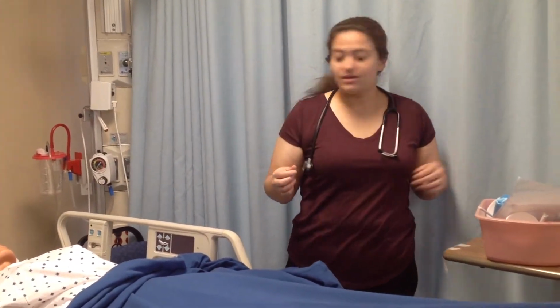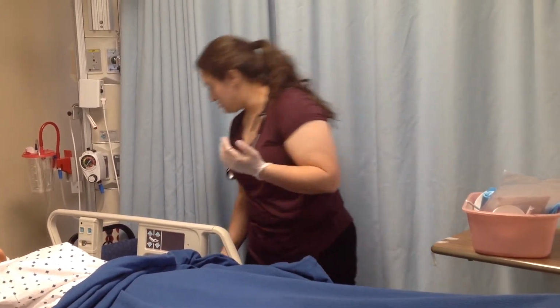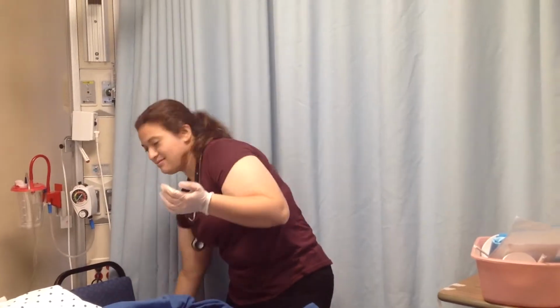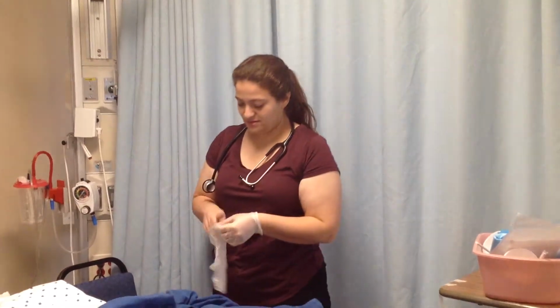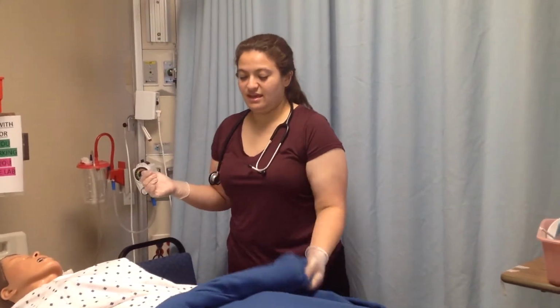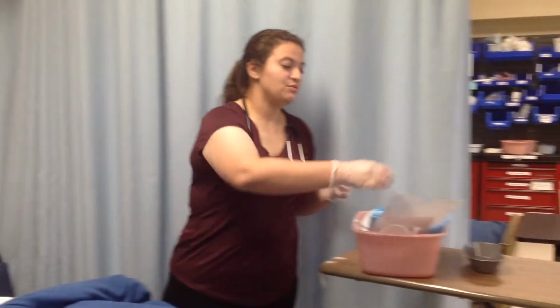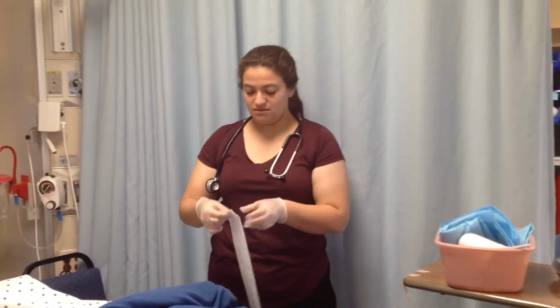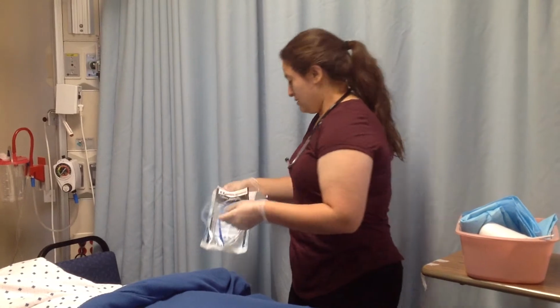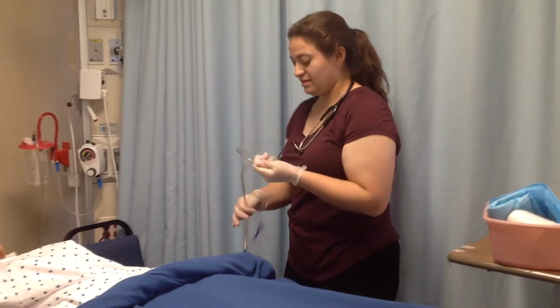So once I've done that, then I would go ahead and put my gloves on. I'm going to put that down. Put these other gloves on. And first things first, I'm going to measure the patient for the tubing, just to see how long. Okay.